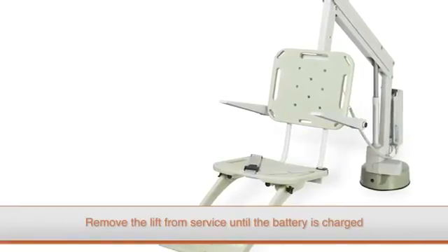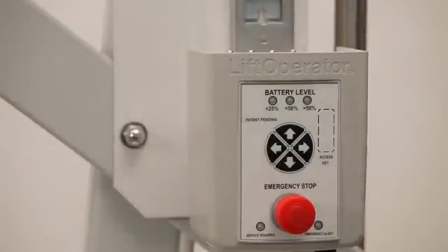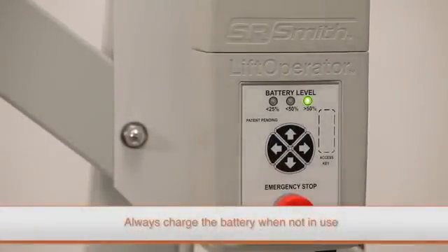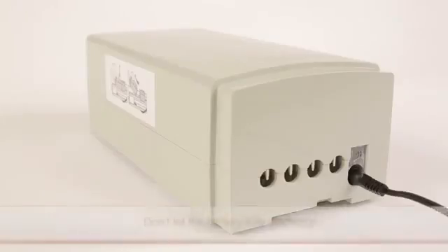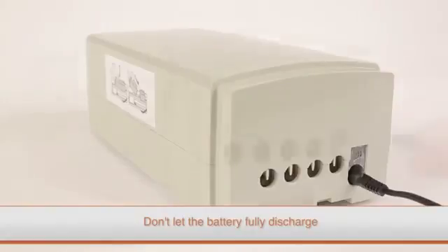Remove the lift from service until the battery is fully charged or the battery is replaced with a fully charged unit. It is important to remember to charge the battery when the lift is not in service. It's critical to not let the battery fully discharge, as this can affect battery life and performance.